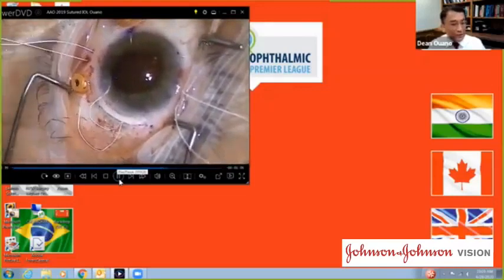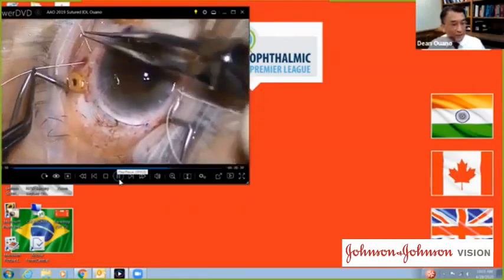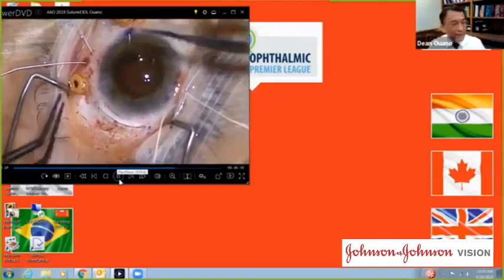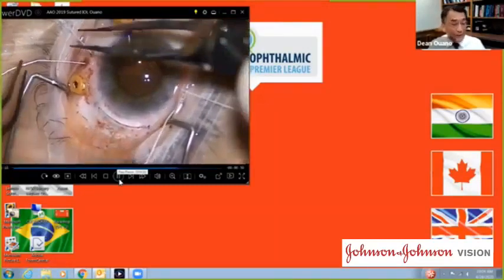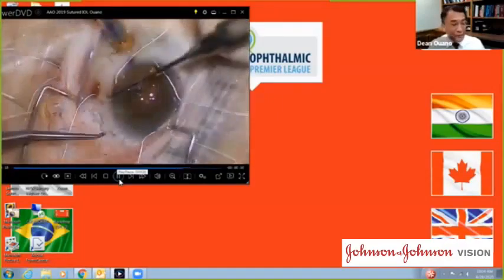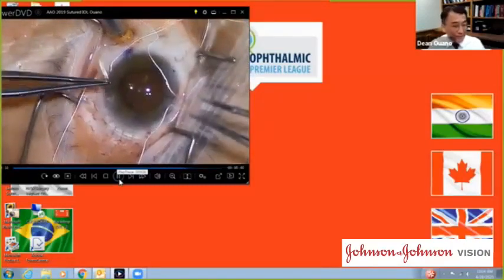You will notice that the lens stays centered before the suture is actually tied. And it makes no difference whether the suture is tied tightly or loosely. And that's because the Gore-Tex suture, which is 90 microns thick, is externalized to a 200 micron needle tract instead of the typical 1200 micron scleral puncture. And notice the stability of the Purkinje images.